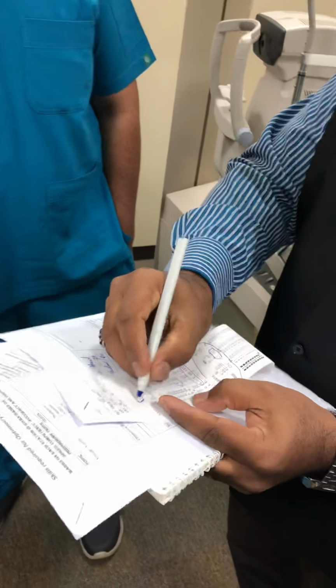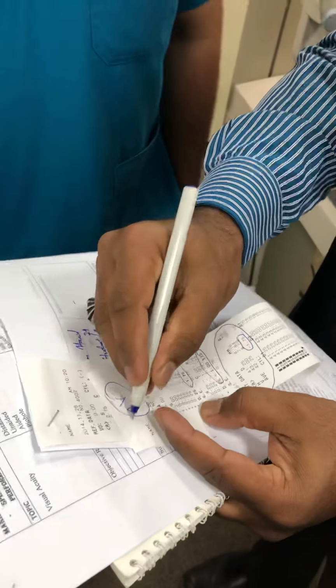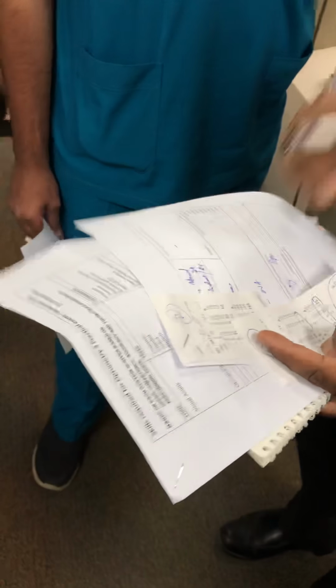So a lot of readings and a lot of things you can get from an autorefractor. And when you select the autorefractor, it should be R and K, which is refraction and keratometry. This was only refraction. So select that and you get this. And if you have a doubt about keratometry, you can always go to a one position keratometer and check the keratometry.